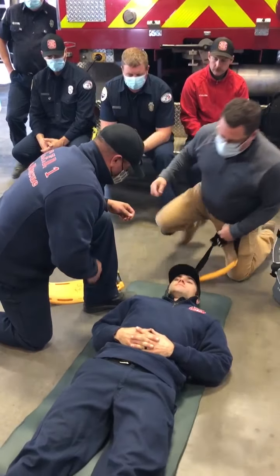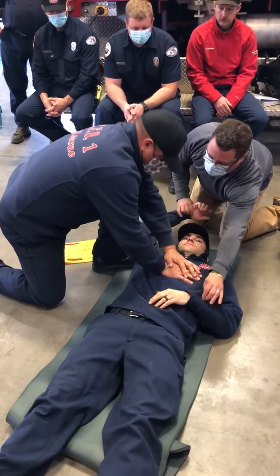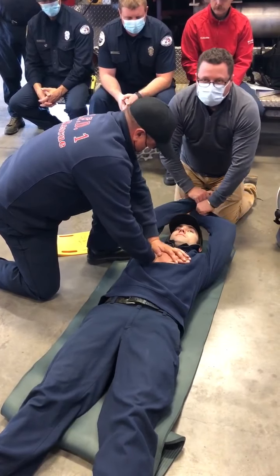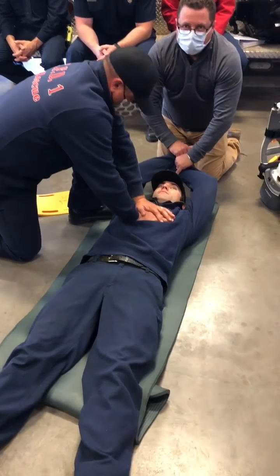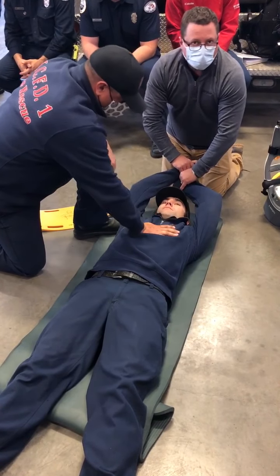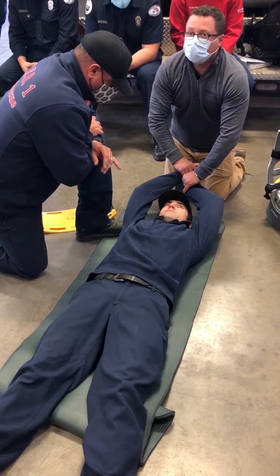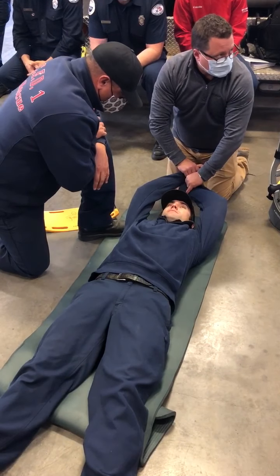I'm going to go ahead and get him set up. He's doing compressions. Ka-chunk, ka-chunk, ka-chunk. Do you see what just happened to his chest when I did that? Look at how much more real estate I now have to work with. Especially when we get into that 250, 350 patient range, it's going to be really critical you get every ounce of real estate you need.